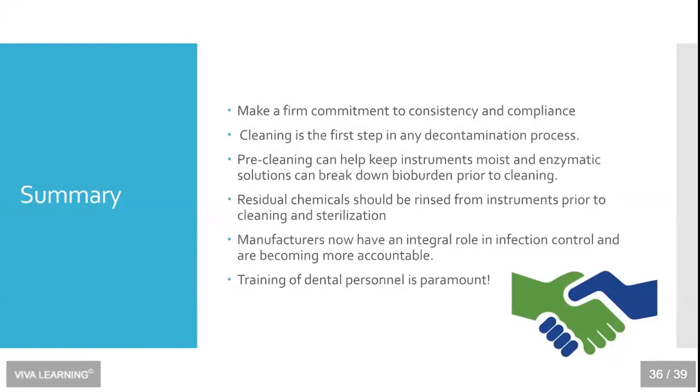Finally, here is my summary, and I would like to make sure that we all have a firm commitment to consistency and compliance. And consistency means that we perform the same functions the same way each and every time. Just as we do with regard to standard precautions and patient care, we should be applying the same principles to instrument processing. Our process should be consistent each and every time. I stress the importance of cleaning as the first step in any decontamination process.